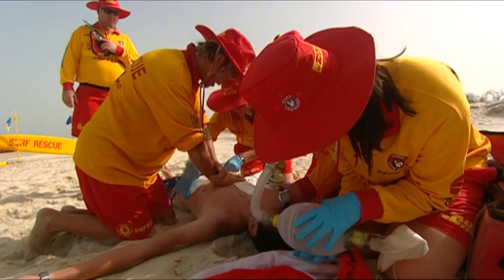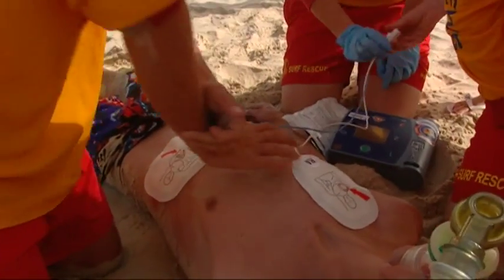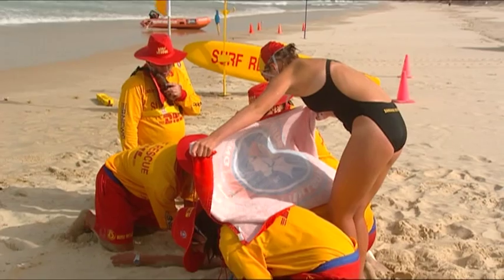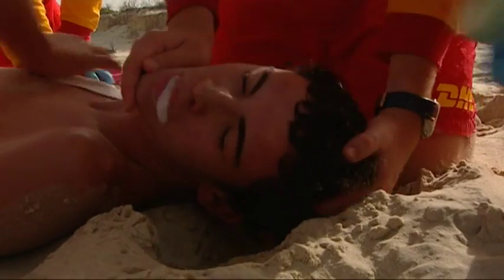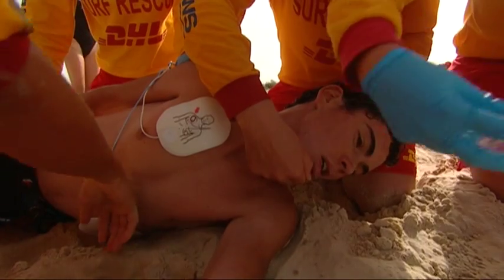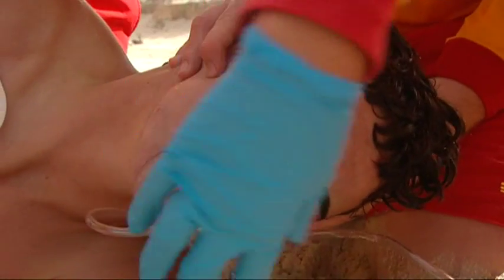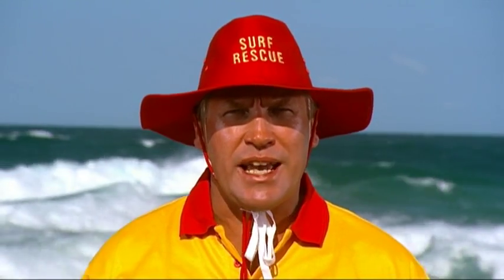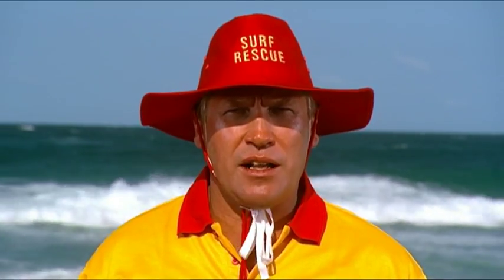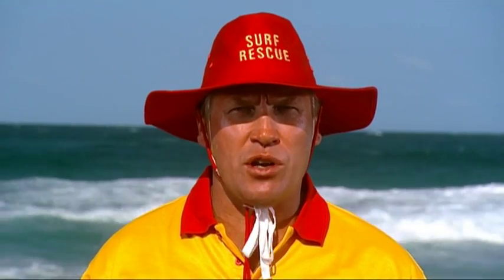A defib can be used in conjunction with an oxygen resuscitator. However, the operators must make sure there is no concentration of oxygen around the casualty's chest and no buildup of gases around the scene, as this could cause a spark. The electrode pads are placed on the patient's bare chest. The AED manufacturers will have instructions for applying the pads on the pad packaging and on the pads themselves. The operator follows the voice visual prompts of the AED. On the stand clear prompt, all rescuers must have no contact with the patient.